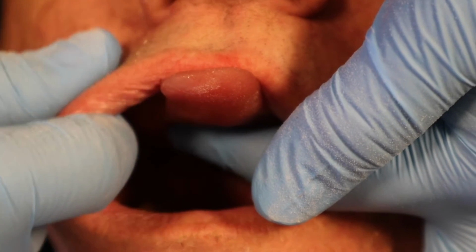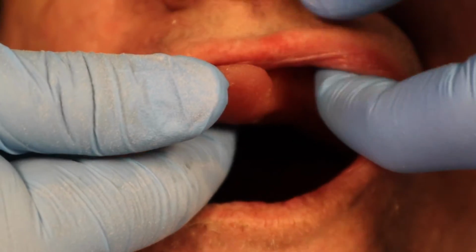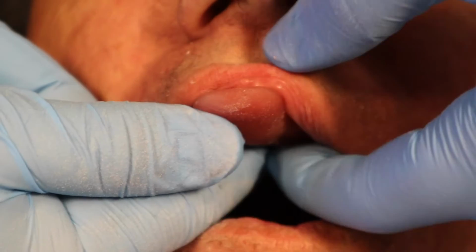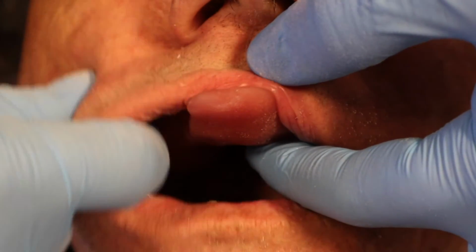So first I put the custom tray in the patient's mouth, and then I wiggle their cheeks around. So I'm actually just moving their cheeks. You see me pulling down their lips, pulling down their cheeks. I don't like how my handle's kind of sticking out the front because it makes things harder for me. So I actually like it when the handle's sticking straight down.